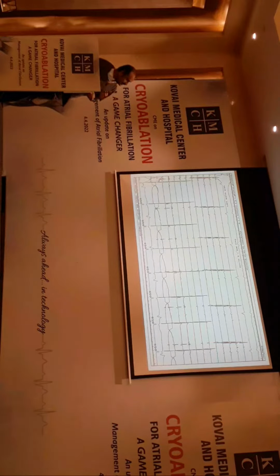Here you can see I am pacing the pulmonary vein, but it is not connected to the coronary sinus electrogram. The coronary sinus is going on its own rate, while we are trying to pace the pulmonary veins at a separate, faster speed. None of these potentials have gone into the left atrium. So this pulmonary vein already has an exit block also. So we have isolated and we have proven that there is no more connection between the pulmonary vein and the left atrium. This is very important.